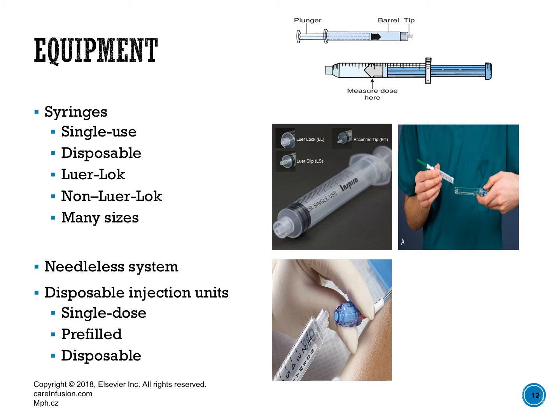If you look at the illustration at the bottom of the page, you have a syringe and then you have a needleless cap. That's usually what it looks like. Your luer lock syringe will just twist into that needleless connector after you've cleaned it, of course. You have to clean off the needleless connector with alcohol for at least 15 seconds, let it dry, and then you can attach your syringe to it.